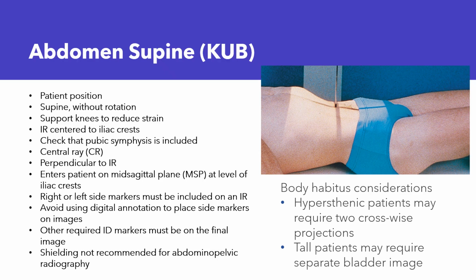That is a plumb line perpendicular to the image receptor. So long as the floor and the table are level, then the X-ray tube should be directed so that the beam is heading toward the floor in a perfect 90-degree angle to both the floor and the image receptor that you've placed inside the table. Okay? So you're working inside the table bucky with your image receptor.